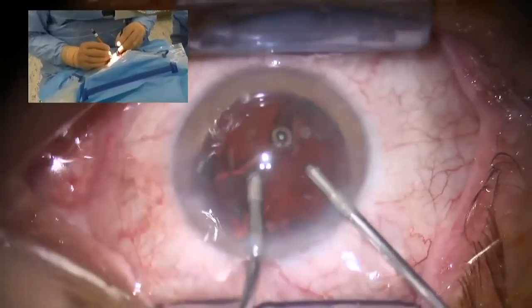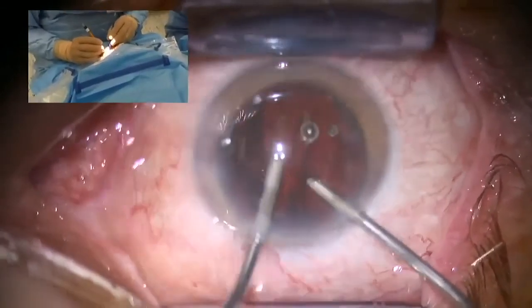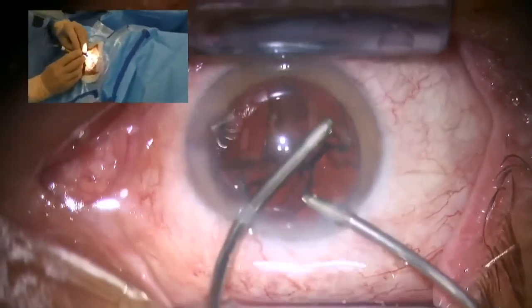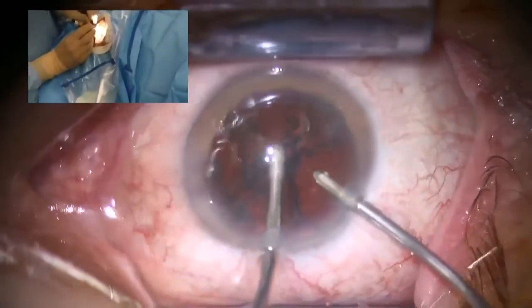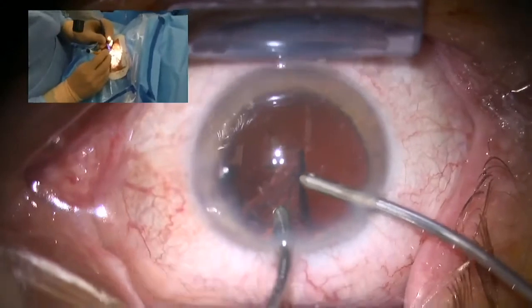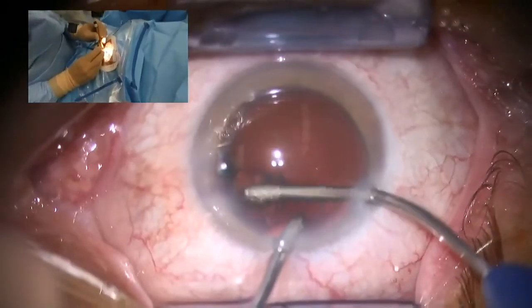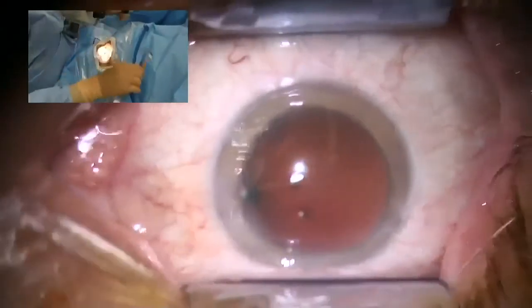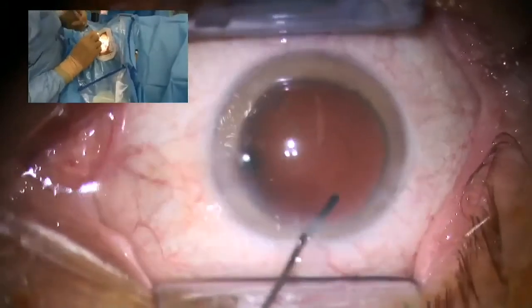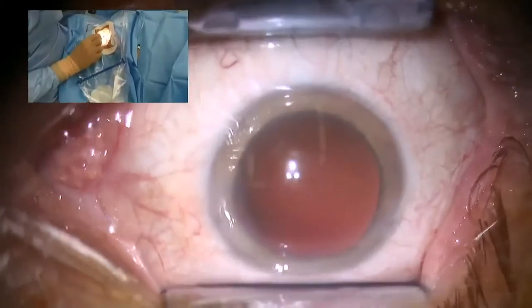So here the posterior part of the lens is a bit more sticky on the capsule. Again, cleaning the posterior capsule with a water jet, preparing for the implantation of the add-on IOL.